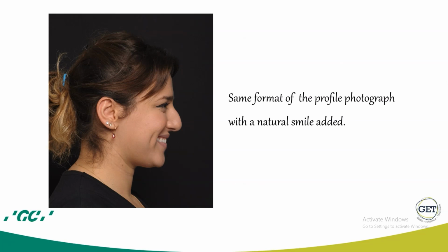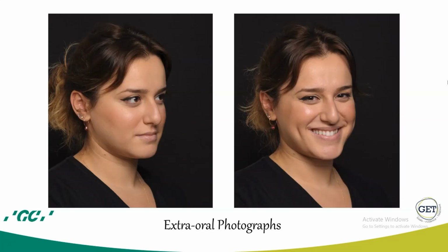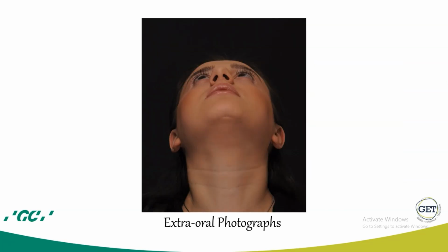In lateral smile, the same format of the profile photograph with a natural smile added should be taken. For extraoral photographs, we may also add a quarter profile and a quarter smile profile. And in cases with asymmetry, a submento photograph can also be added.